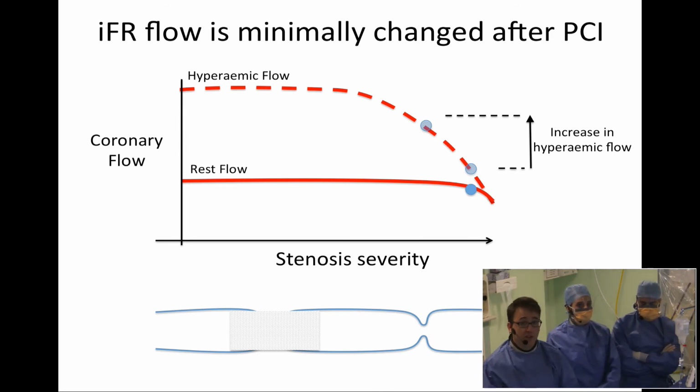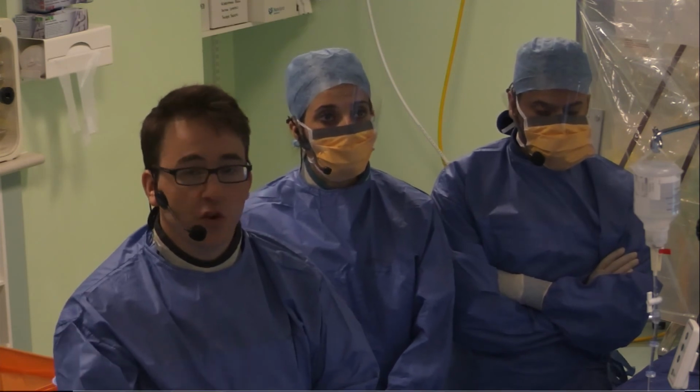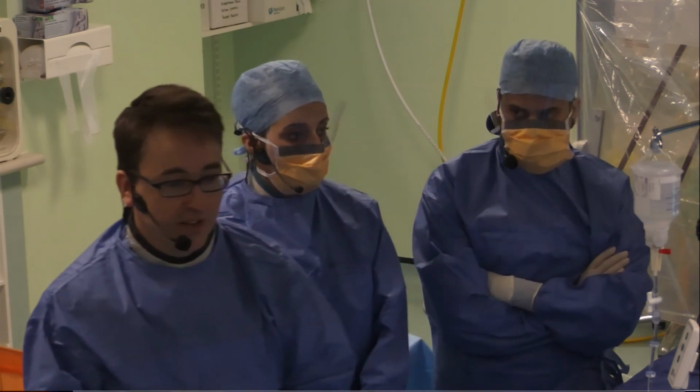Now, I'm warning you this just to be cautious, but more as an educational note, because what we do know is these stenoses are usually very, very tight. So a 90% angiographic LAD stenosis is very, very severe. Probably today it was around about 80% this LAD, and it looked quite tight if you measured it formally by QCA. So just bear in mind, if the stenosis there is more than 90%, the natural physiology would be that flow starts to fall off, whether you're measuring with FFR or IFR, and you just need to be cautious. Hitoshi, I'll hand over to you just to cover that. Yes.